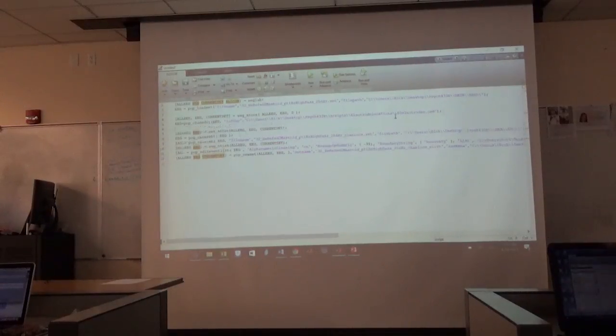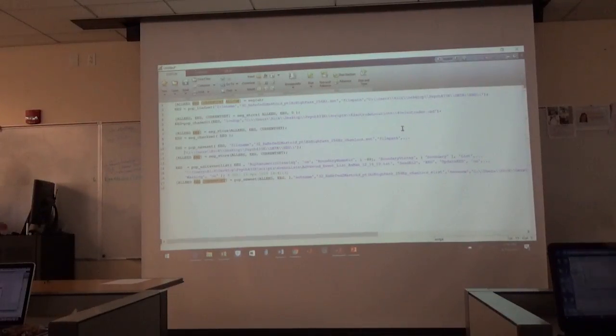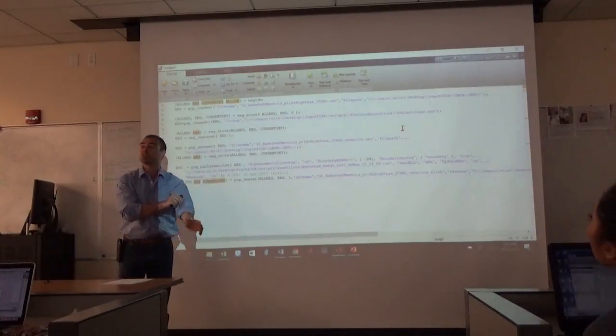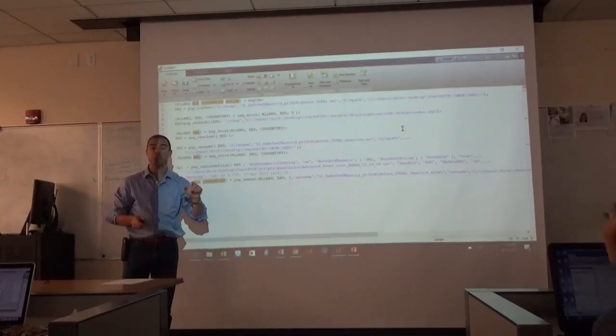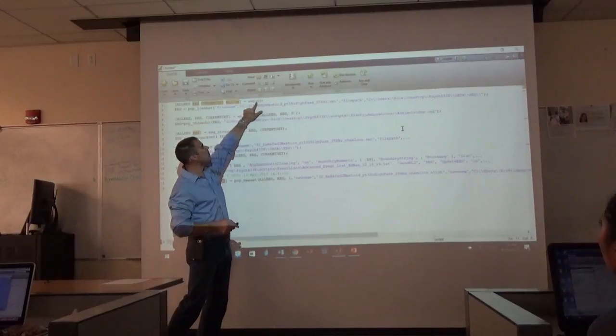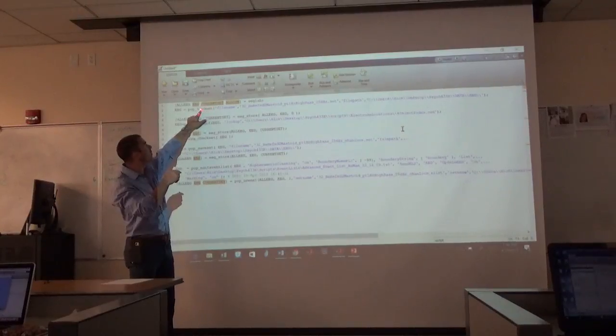Within here, I'm going to create some spacing so we can begin to read it. Okay, let's walk through a little bit what we have. This is the history of what we just did by hand, by manual process. The first thing we did is we typed in EEGLab, and then we loaded our data set. You remember that? It says load set here.